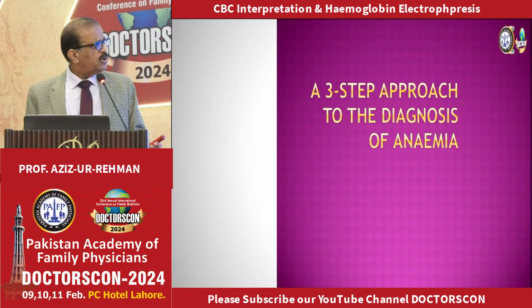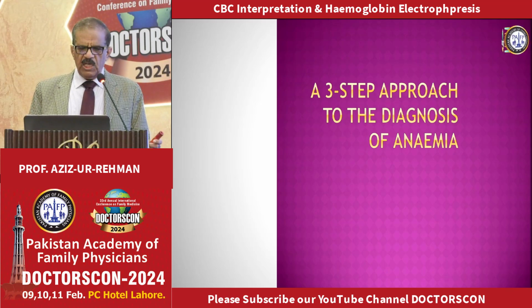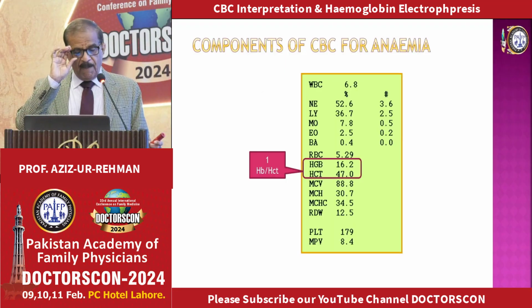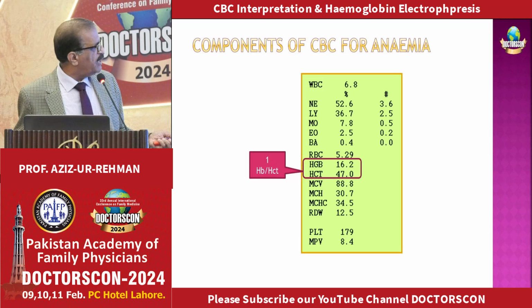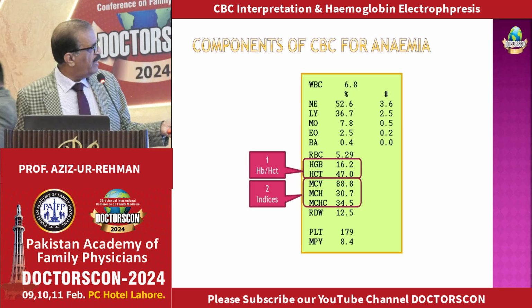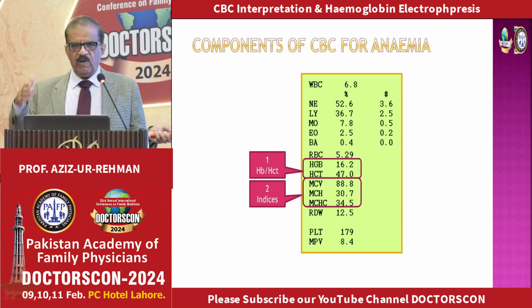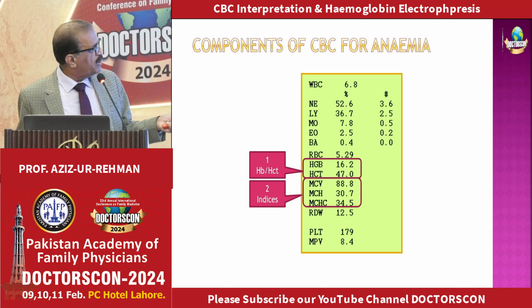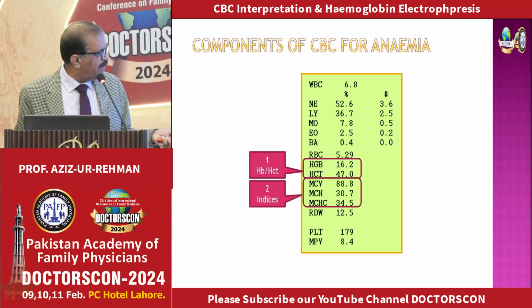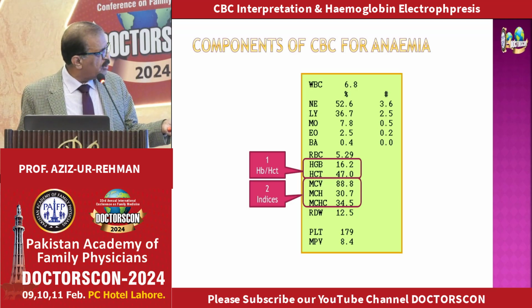Okay. So this is my favorite topic, a 3-step approach to the diagnosis of anemia based on CBC. So this is the example of CBC. The first step is to look at hemoglobin. There are actually 3 panels. This panel is RBCs, which I will be talking about mostly. This is WBC, and this will also be relevant in some cases, and this is platelets. So we will be concentrating on this.